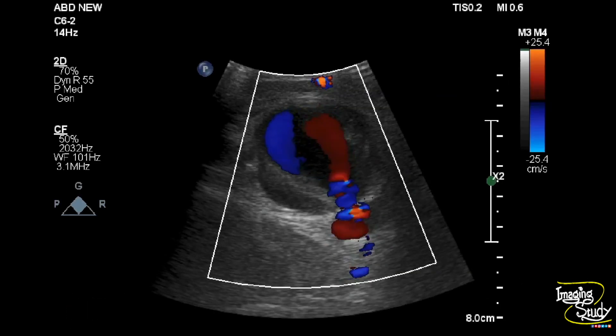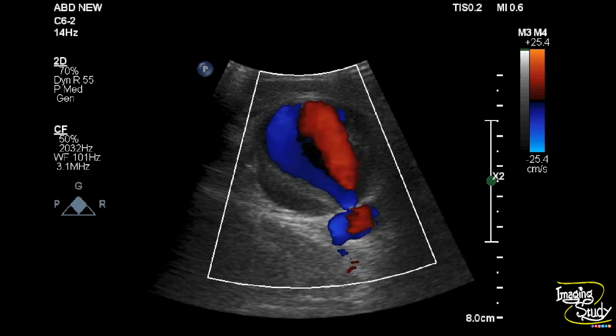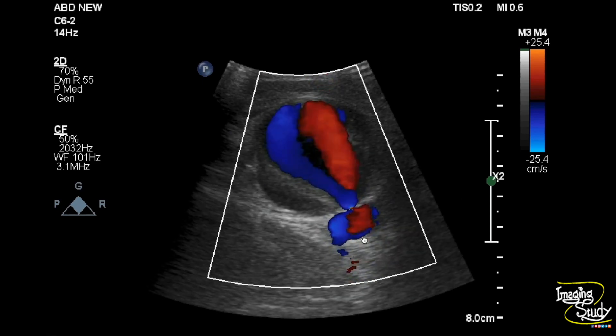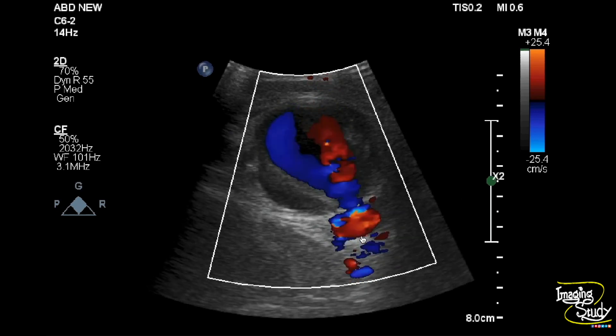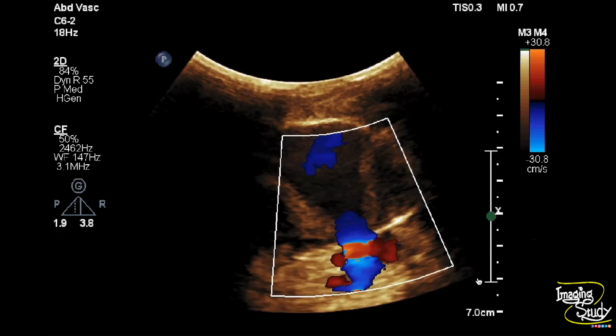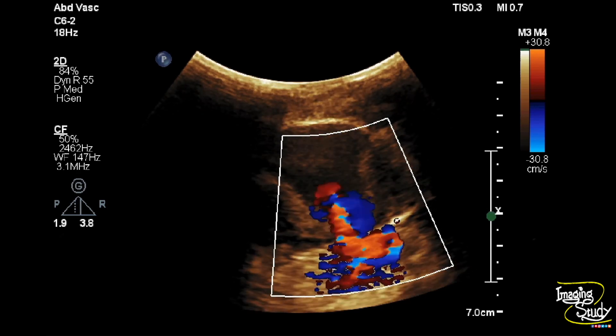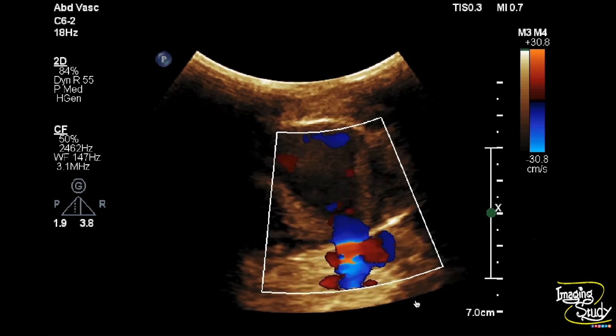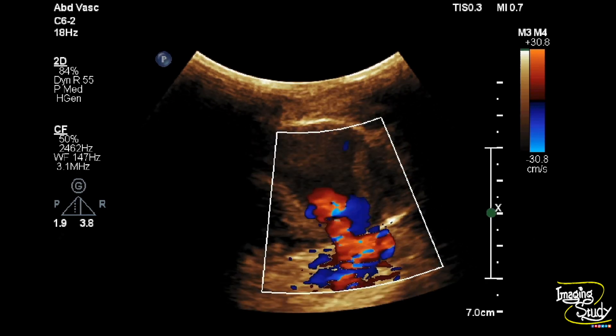Here is the low-frequency curvilinear transducer view, and you can easily see the aneurysmal dilatation with mural thrombi, connected to the adjacent superficial femoral artery.